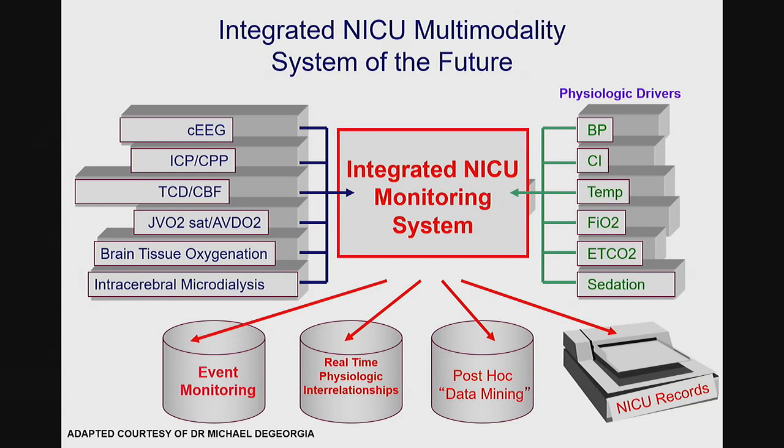And you've got all the machines and devices, and basically I put them in two categories, right? These here on the right are the physiologic drivers, mostly pumps. Right? I can raise your blood pressure, lower it. I can hyperventilate you. I can sedate you, right? I can lower body temperature, hemodynamic augmentation.